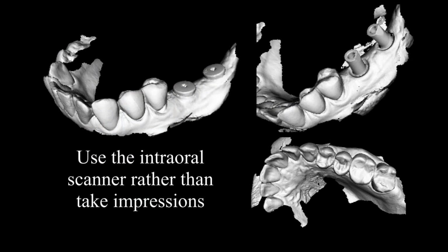See, the scan bodies have libraries, and so the lab you're using must have that library of scan bodies. And then we can give you the scan bodies because you can really use them. But this patient here, I knew the scan body that I needed. I took the healing abutment, and I scanned the patient with the healing abutments in place. Then I just took those out, and you just eliminate that one little area, put the scan bodies in and rescan just those. So you just rescan this area here, and then you get these images.